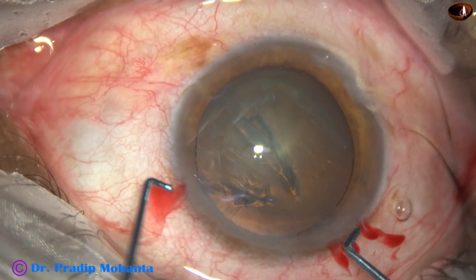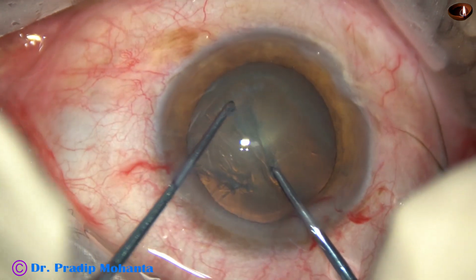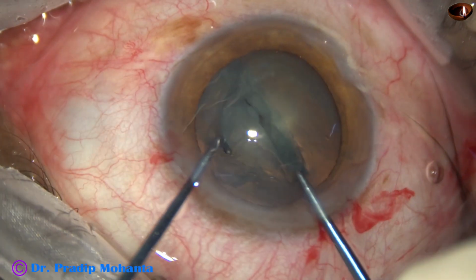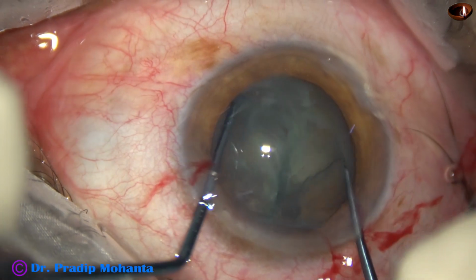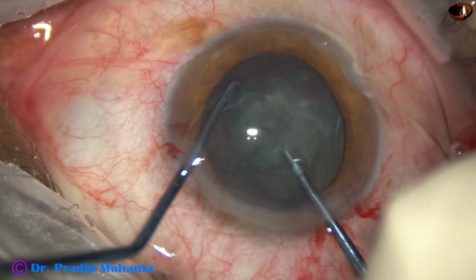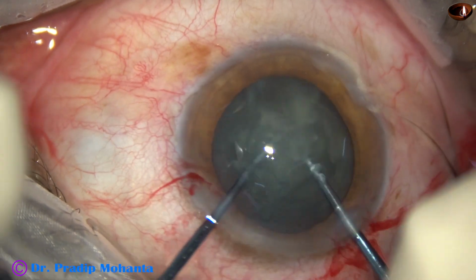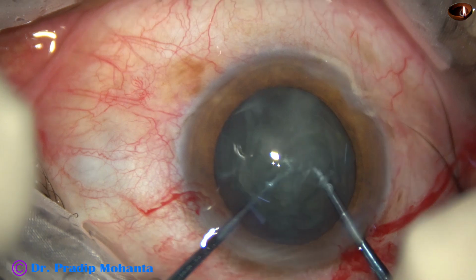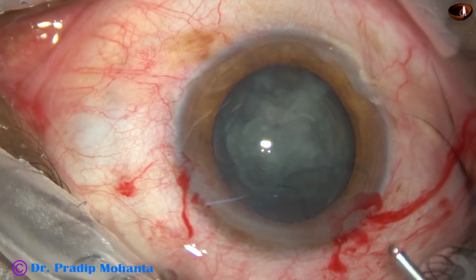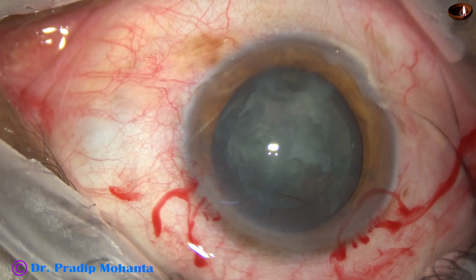And the best thing is to pre-chop in this way. This is Mohanta's pre-chopper and this is the sustainer, and these two instruments very easily divide the nucleus into pieces. And we have got 4 pieces out of this. And now management of this nucleus has become so easy.